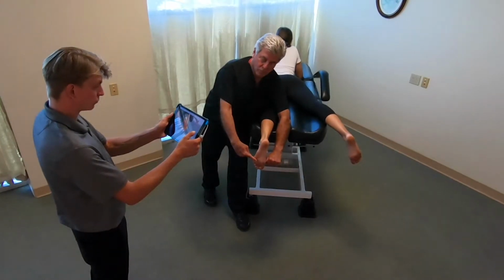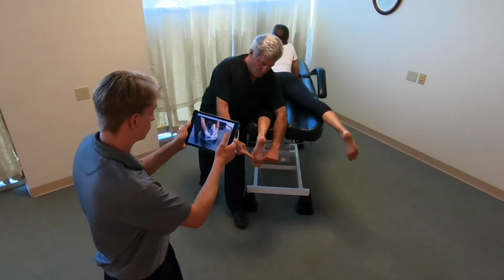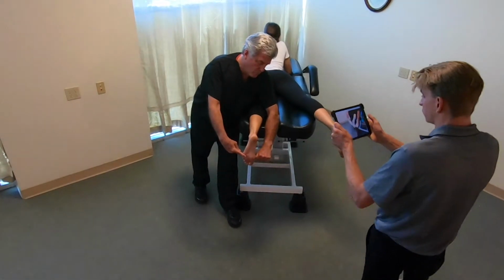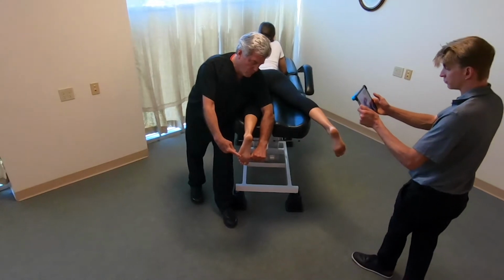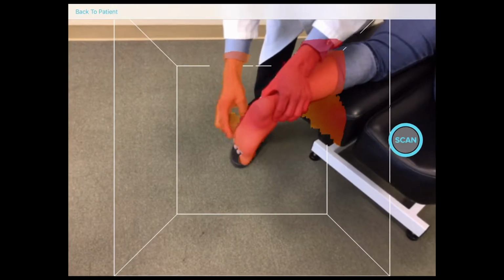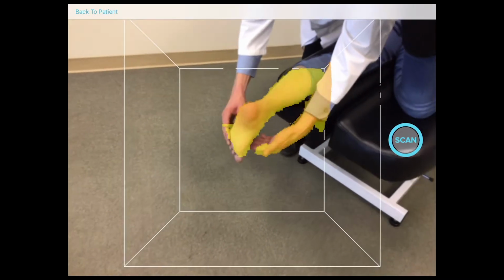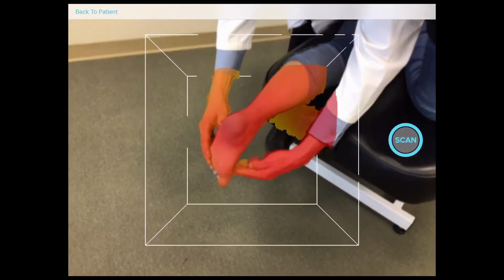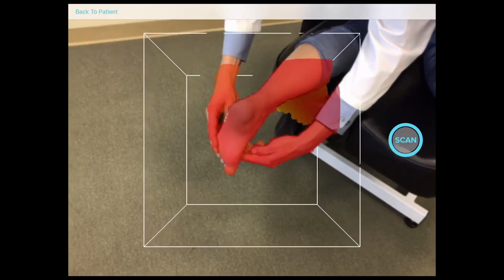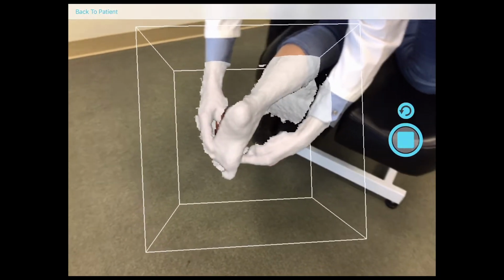When taking the scan, position yourself on either the medial or lateral aspect of the foot, a short distance from the patient. Maintain this distance during the entire scanning process. The scan data to be captured will appear as a red to yellow gradient inside the cube. Simultaneously adjust the size of the white cube on the screen while moving closer to or further from the patient until all of what you intend to scan is inside the cube and covered by the gradient.